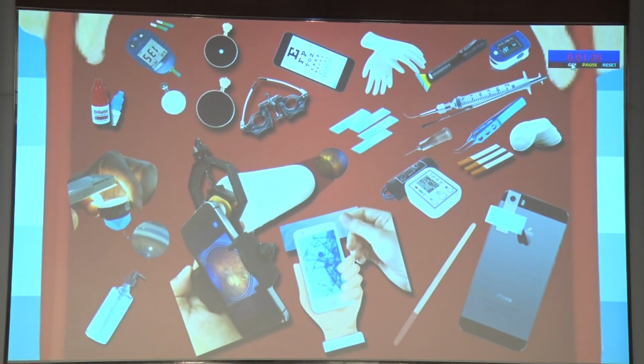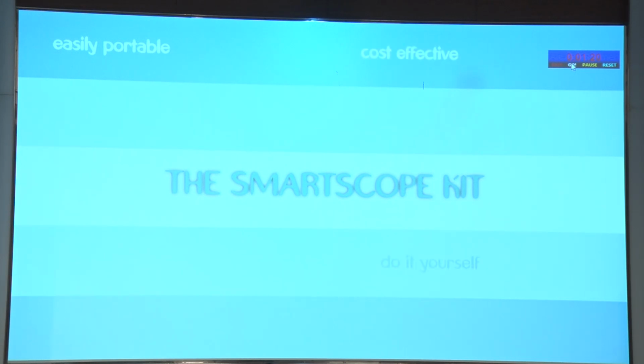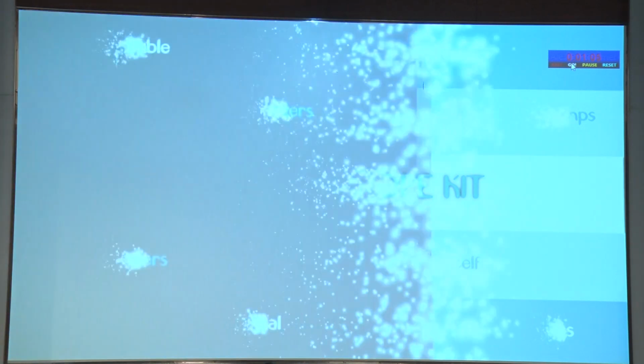It is smartphone based and helps us in storing images, videos, helps us in teleophthalmology for expert opinion and for resident learning and teaching. It is easily portable, it's a do-it-yourself, cost-effective, universal kit which can be used in peripheral centers, local clinics devoid of expensive equipments. Also, it's ideal for examination of patient in outreach camps.